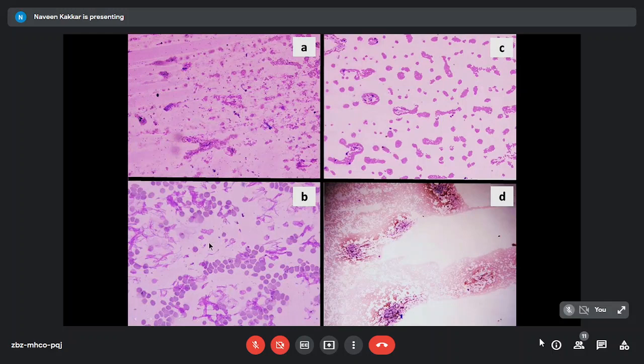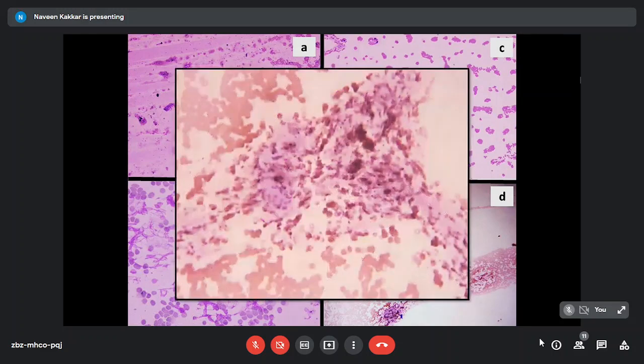They can cause various interferences, but in our case, we also have WBC interferences. It is important to screen the tail for this. Again, in the tail, you can see blobs of this fibrin. These are too big to be aspirated, but if these are there in the sample, expect smaller ones here and there, which will cause interference in your counts. That's a big one in high power.